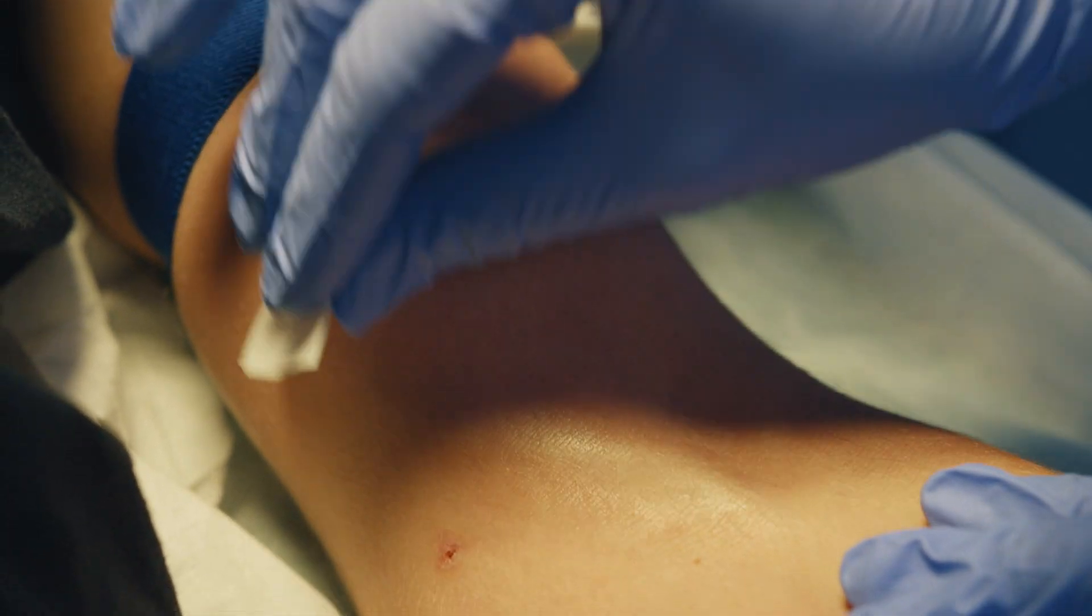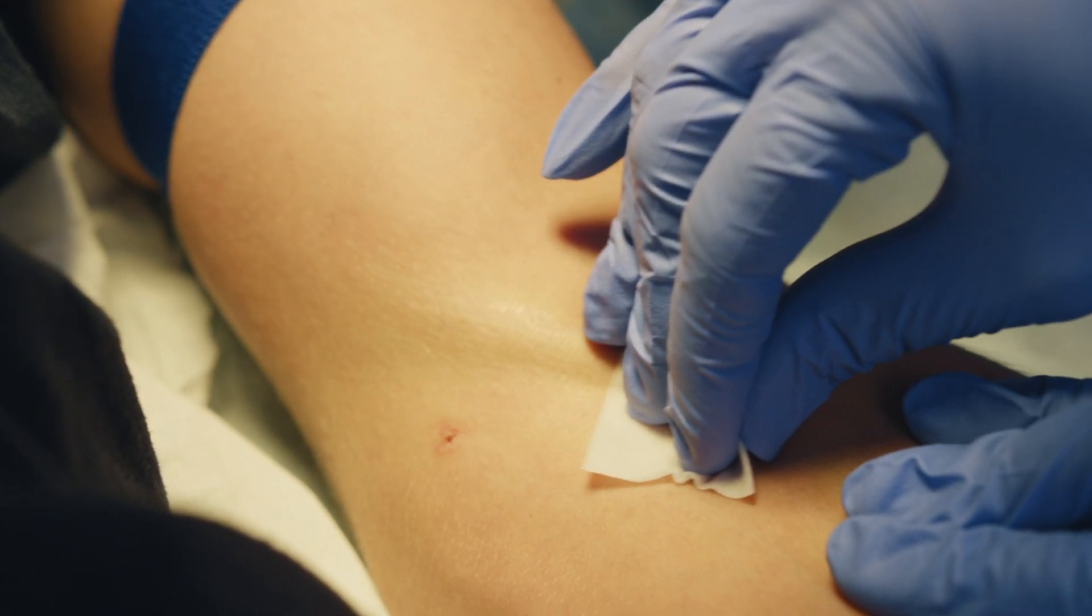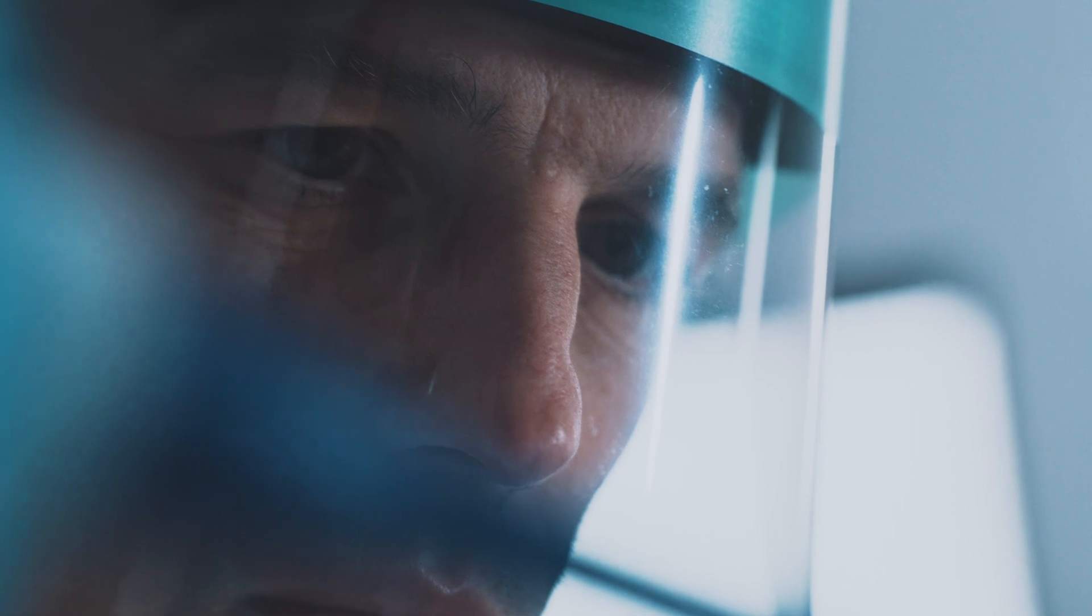When patients go into a clinic, they often give blood to a doctor to measure biomarkers, which are little markers inside that blood that indicate the status of disease or health. Those samples have to be taken away from the patient to a clinical lab where they're processed and analyzed, and that can take several hours.